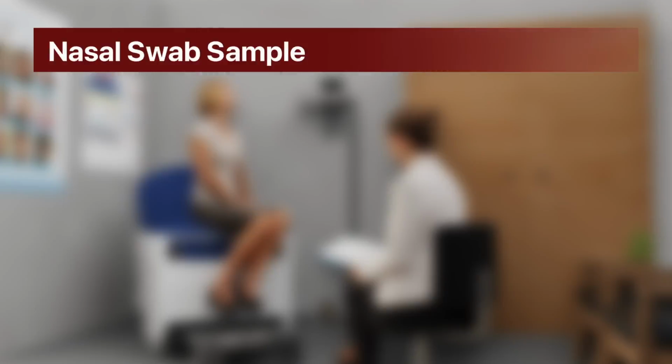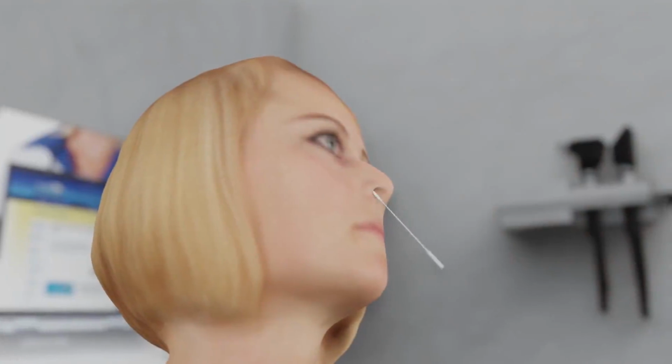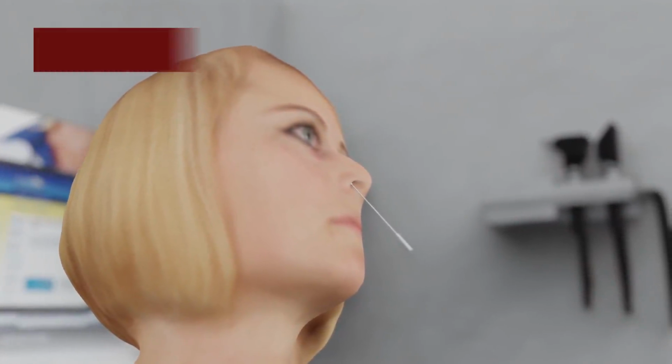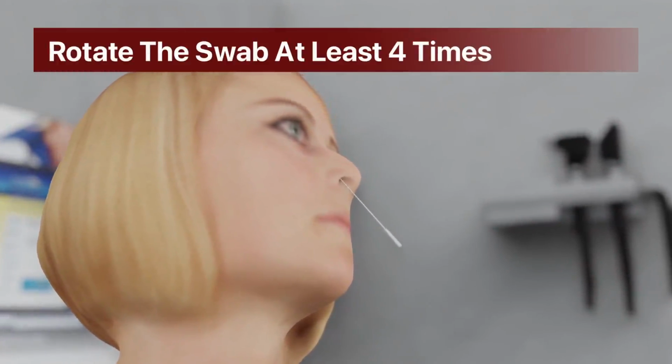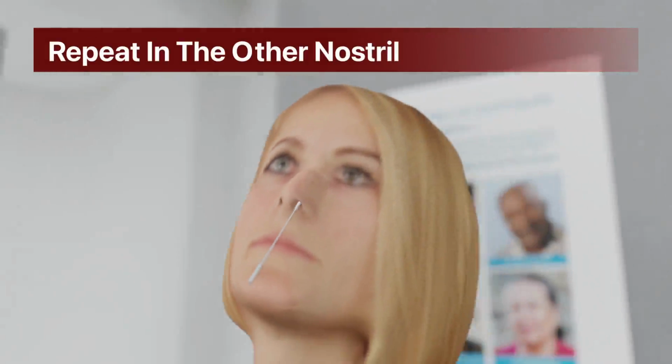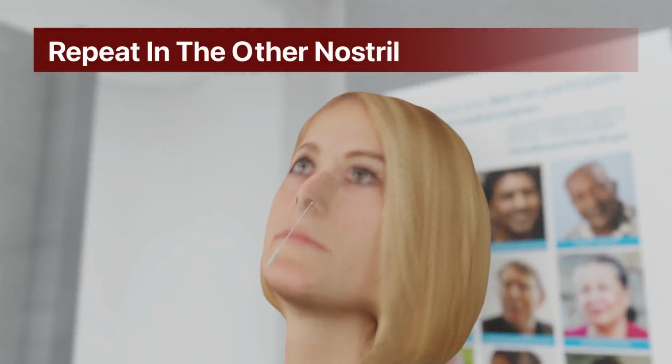Nasal swab sample. Gently insert the sterile swab no more than 3/4 of an inch into the nostril. Rotate the swab at least 4 times against the nasal wall. Remove the swab and repeat in the other nostril using the same swab.